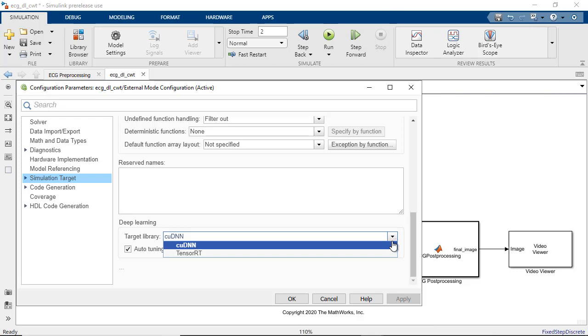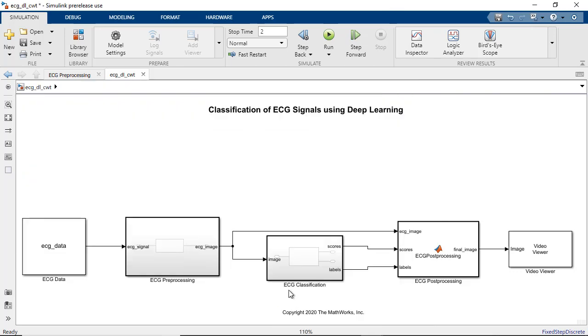With these settings, Simulink will identify and run parts of the Simulink model including the deep learning network on the GPU.